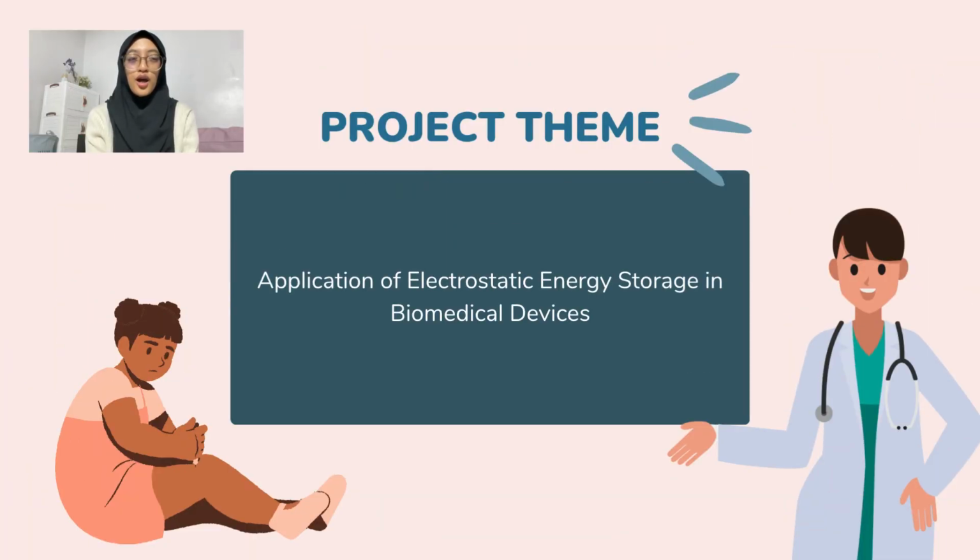So today, our group will be presenting a project related to biomedical technology, focusing on the theme application of electrostatic energy storage in biomedical devices. Electrostatic energy storage is a key concept in medical electronics. It typically involves storing energy in electric fields using a capacitor. This energy can then be released quickly, making it ideal for applications where sudden bursts of power are required.